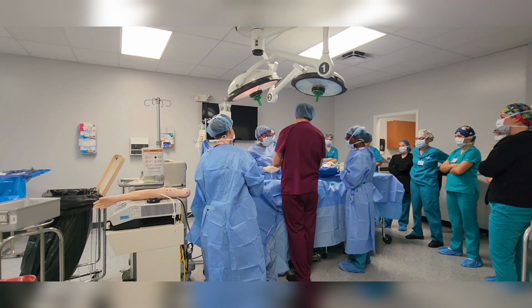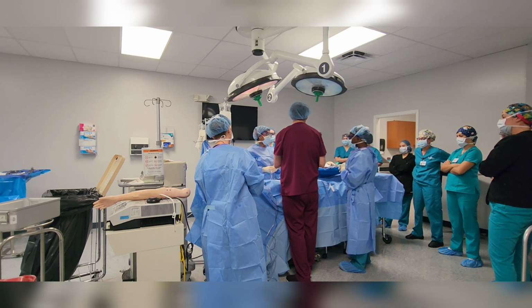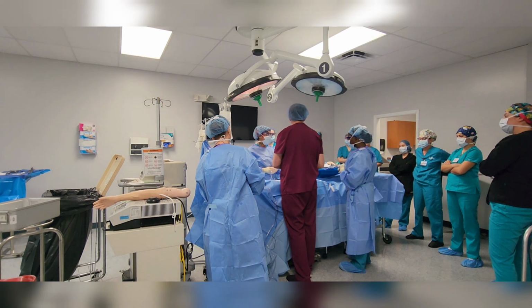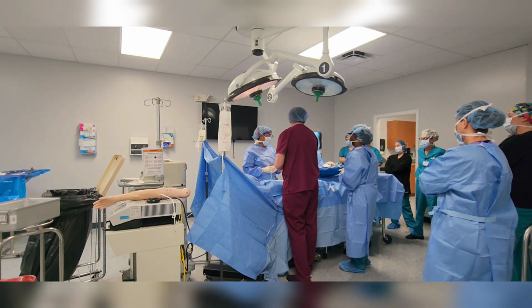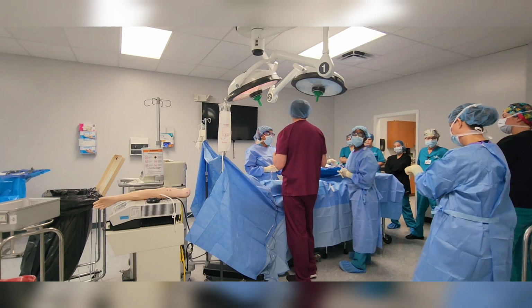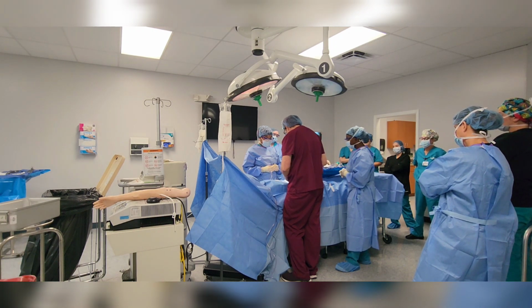So this is straight. Here, I'm just going to show you a little thing. Hold your hand out. Tell me which one feels better. If you have it, just hold your hand out. Right. So they feel like you're there. Because a lot of times they're looking down. You're right, and they're looking down, right? So straight hemostat there. So hold that with your hand.